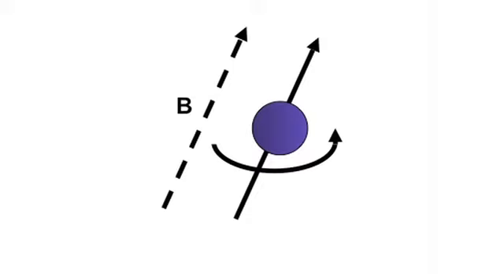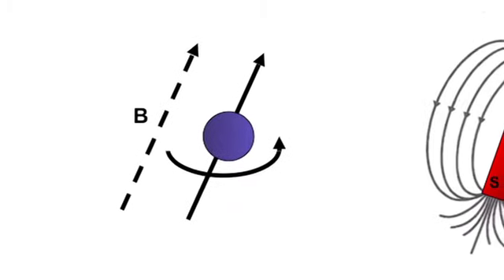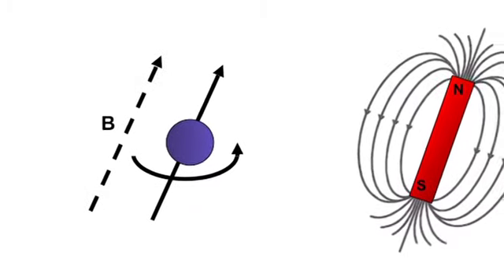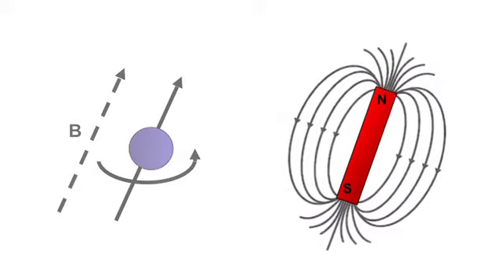It all starts with the spinning hydrogen nucleus. Biological tissues contain water, and hydrogen, of course, is part of that. Because the hydrogen nucleus has a positive charge, being a proton, when it spins, it generates a magnetic field. So it has a magnetic dipole moment, a north and south pole.